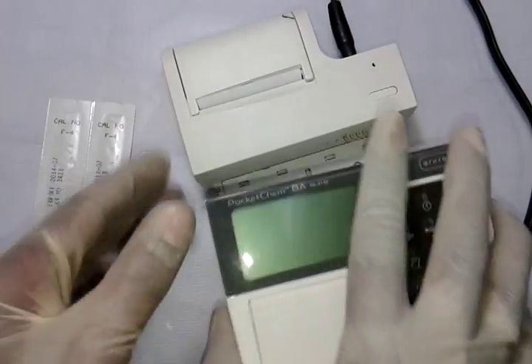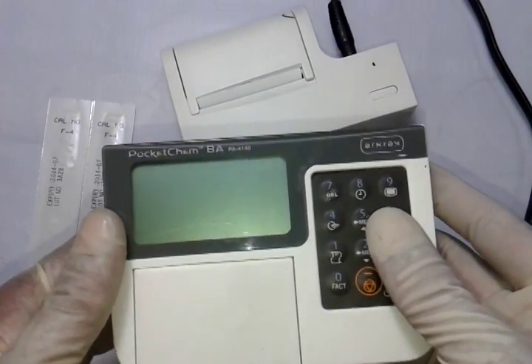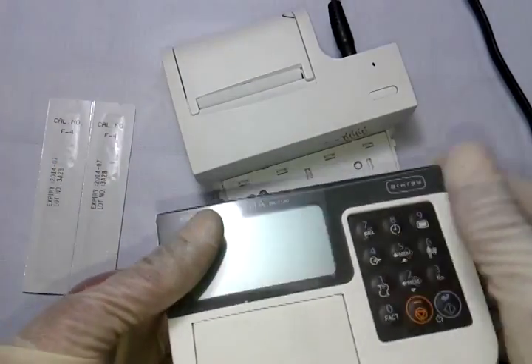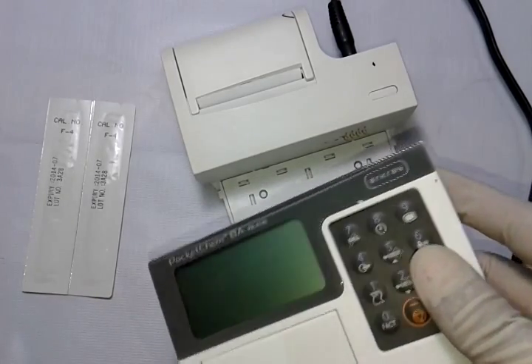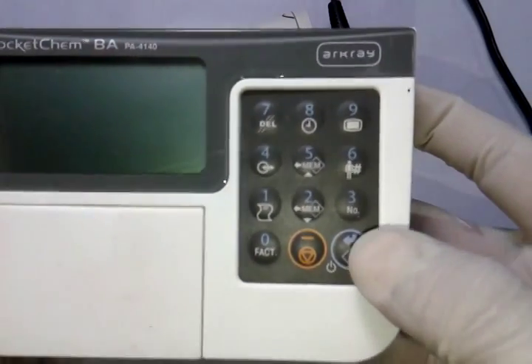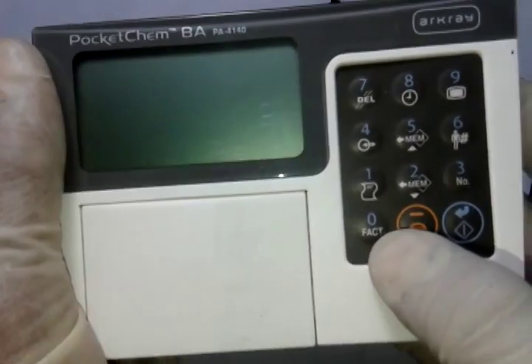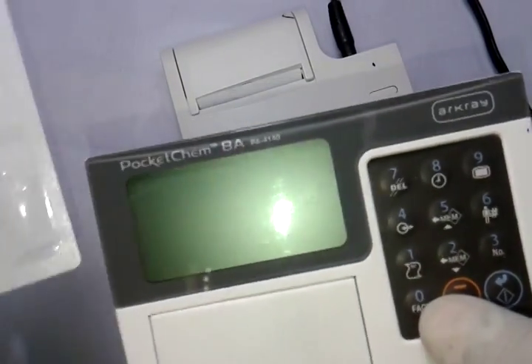The device is a two-piece unit: the upper part is the thermal printer, and the lower part is the actual analyzer instrument. You can carry the analyzer to the patient bedside — it holds memory — and when you return, reconnect it to the printer and take out the readings anytime. The keypad has a blue power button, an orange cancel button, and a zero button for feeding the strip code number.